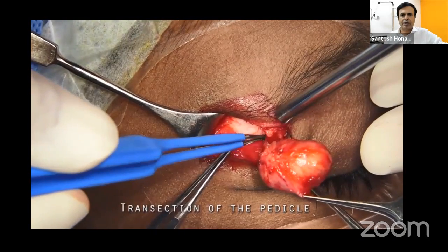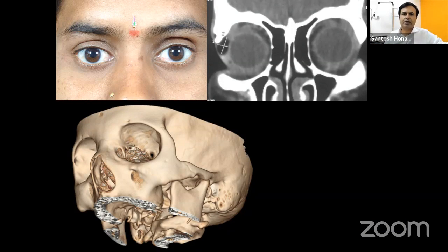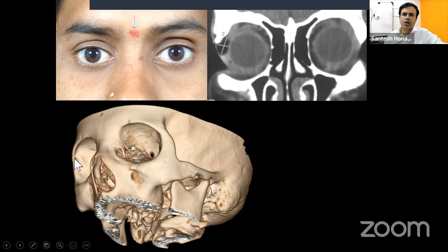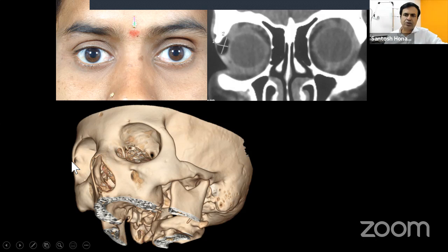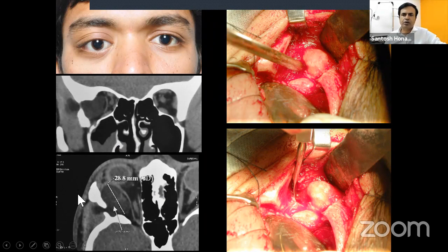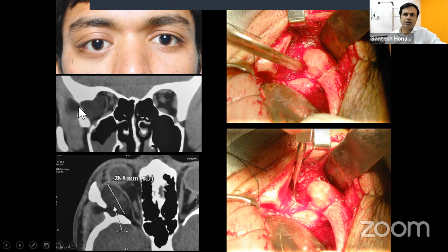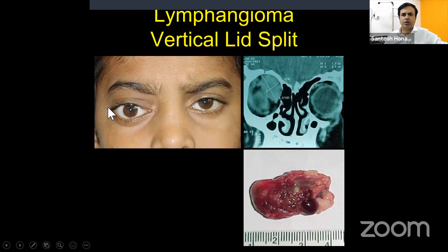Be careful: a dermoid may have extra-orbital extension through a bony defect. If a dermoid is not completely palpable or doesn't move well, suspect a dumbbell dermoid. 3D CT shows the bony defect. For a gross dumbbell dermoid with extra-orbital and intra-orbital components, make osteotomies on both sides of the bony bridge and excise the entire lesion — extra-orbital, intra-orbital, and defective bone — in one single piece.